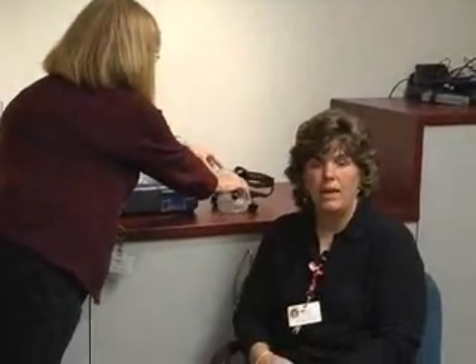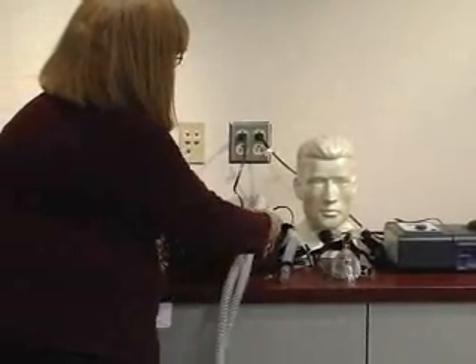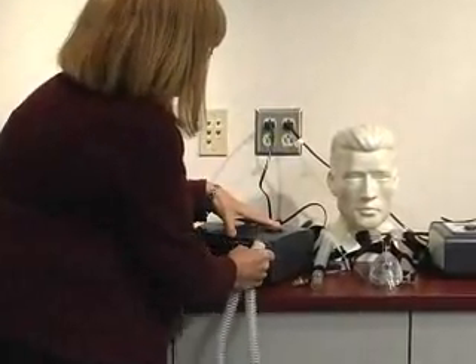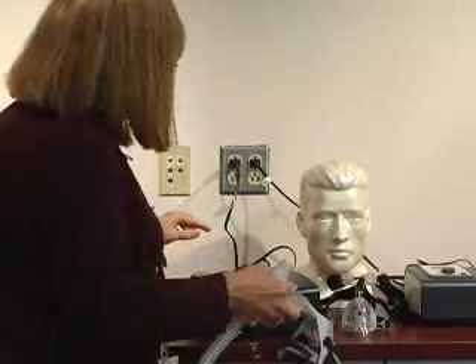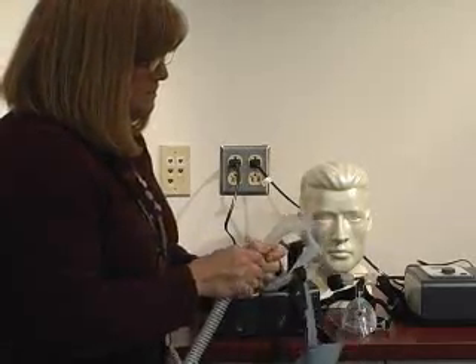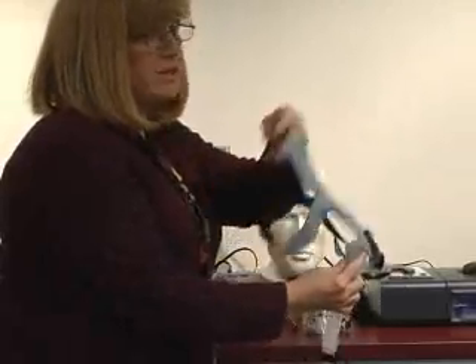One thing to keep in mind: when putting any mask on a patient, be sure that you have the tubing connected to the mask ahead of time with airflow going through the mask — otherwise the patient could feel claustrophobic or scared. To place the tubing onto the patient's CPAP device, it's located at the back of the unit for the M Series Respironics — it's a rocking motion up and over. The same motion goes to the base of the mask as well. Always turn the unit on before the application device is applied to the patient, then rock it up and over and apply pillows into nostrils first, headgear up and over.